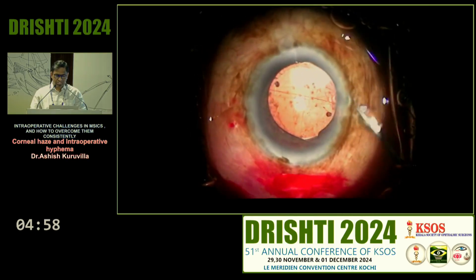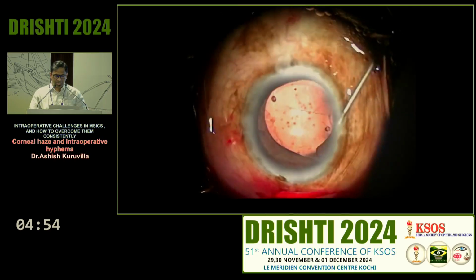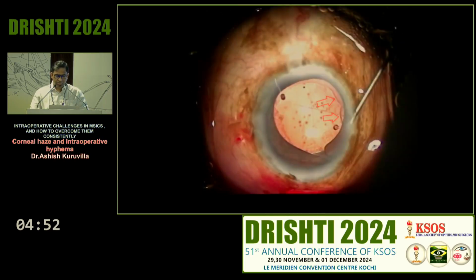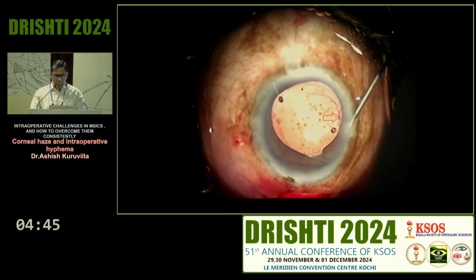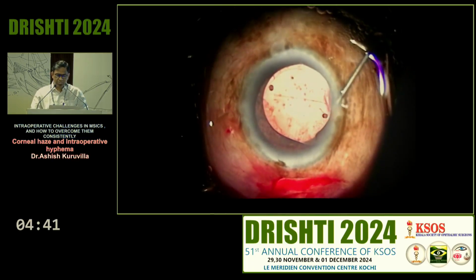This is one such case. Everything is over, and it's finished, and then you're just hydrating. In the last step when you're hydrating, you can see those two bumps over there, where the arrows are pointing, and when you're hydrating, have a look at what happens to that bump. It has gone and become a Descemet's detachment in that area.